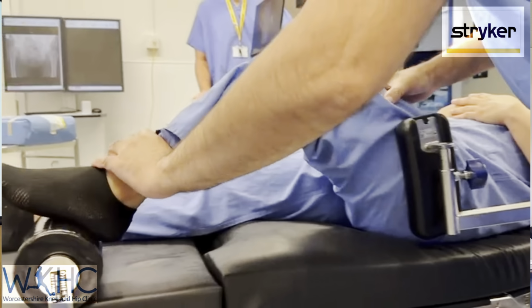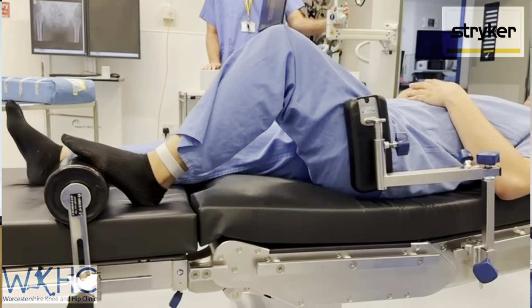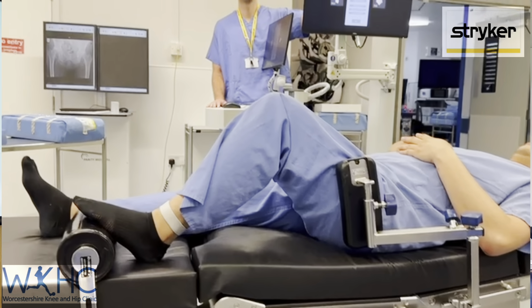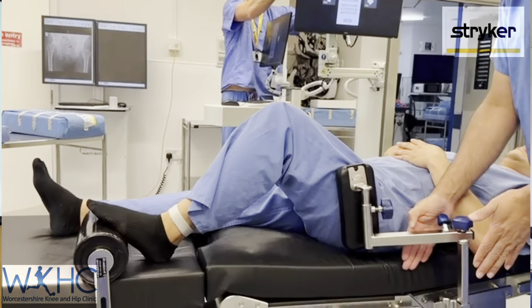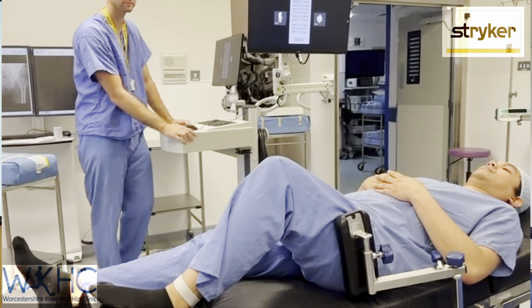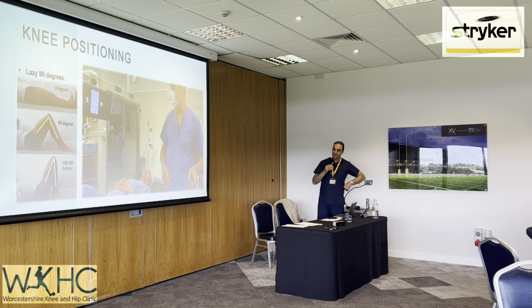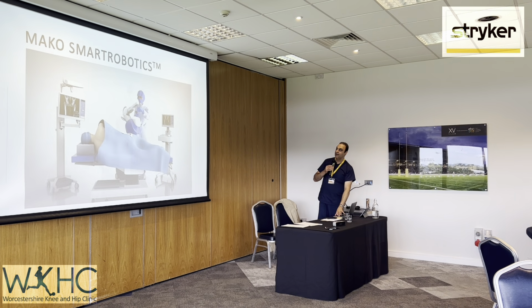Now this is our scrub staff. You can see we've got a catheter bag on him, so he doesn't have to go for a coffee break. So anyway, we've got him positioned there. Make sure for the knees that you position him close to the side of the table, because you don't want to position too flexed or too extended. You want to aim for a lazy 90 position.